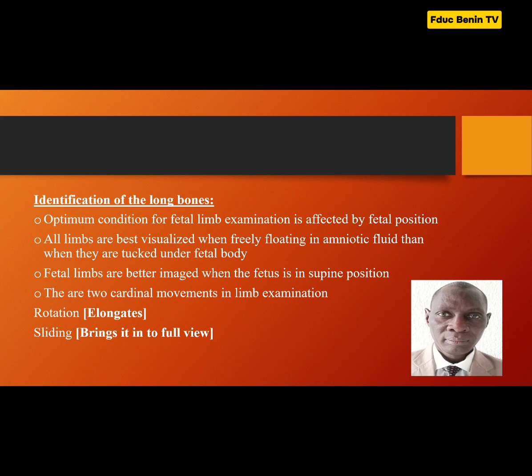Again, there are two cardinal movements in limb examination. The first is rotation. A rotation elongates the bones. The second is sliding, and sliding brings it into full view.